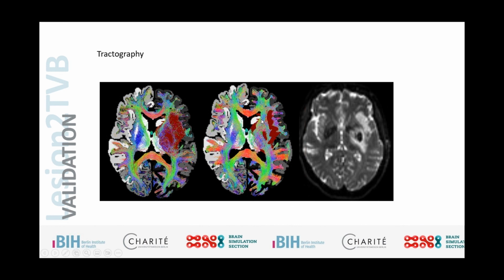And we see that actually the way these traces go, especially with the hole here in the middle, is very representative of what we also see in the lesion. So we see that the center of the lesion here, the very dark spot, is actually not tracking any tracks, but rather we have tracks going around and trying to circumvent this that are still viable and still valid. If we think about the slide before, there are still tracks, and the probability is still not 0 that these tracks might actually be there and then also recover over time.